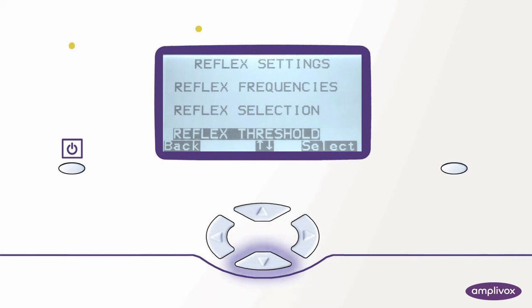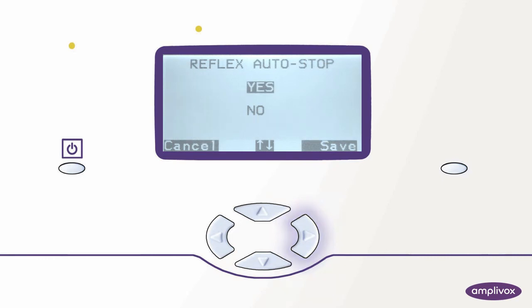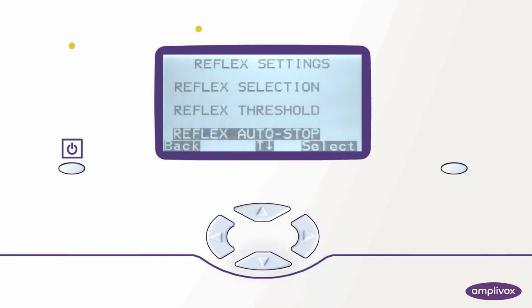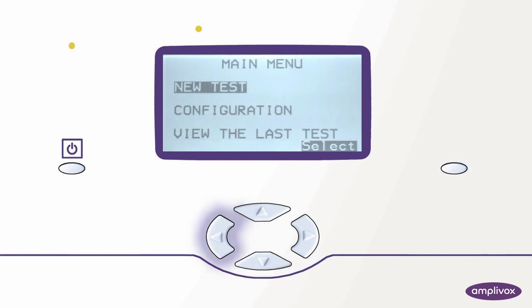Let's go a bit further down in the list. Reflex threshold is nothing we would like to change today. Reflex autostop we would like to activate in order to stop testing a frequency when a threshold was found. We have reached the last point in the list and as we don't want to change the filter we select the left key and are brought back to the main menu.